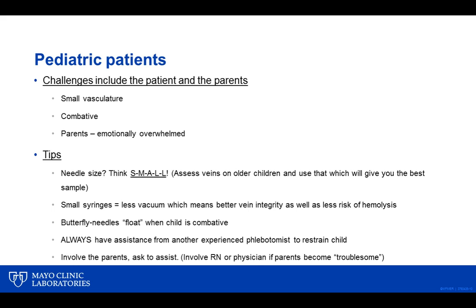And then they can be combative. And so this is a time when you should ask for some assistance and have another technician assist you. Bringing the parents into it is a situation where you need to assess whether or not the parents are capable of assisting, depending on how emotionally overwhelmed they can be. I still am reluctant to involve the parents in helping me hold, or helping with the actual venipuncture process. I'm much more comfortable having another phlebotomist help hold the limb.